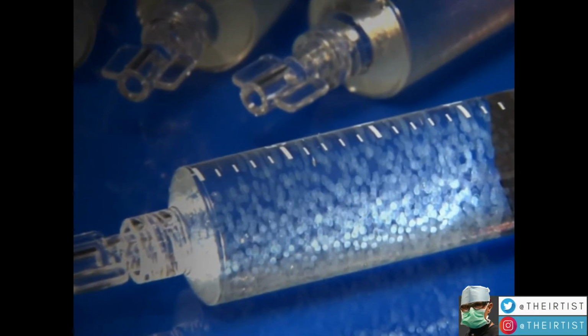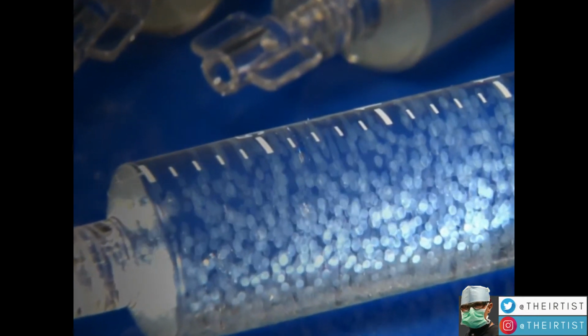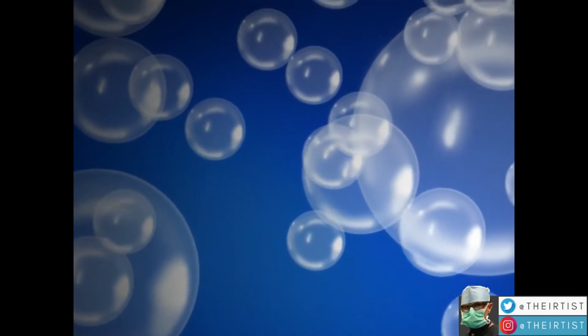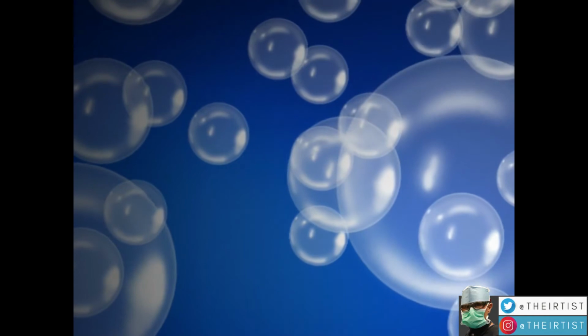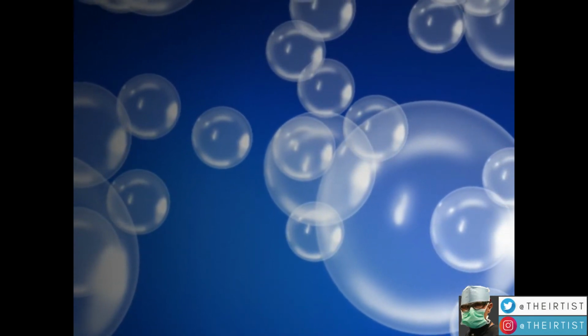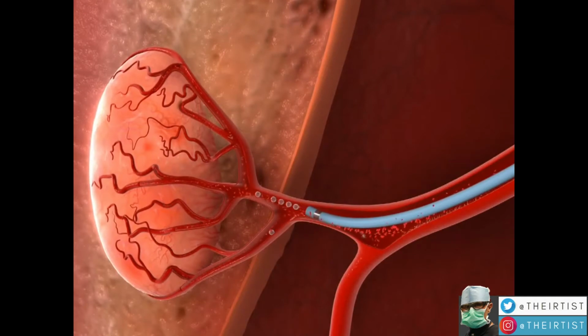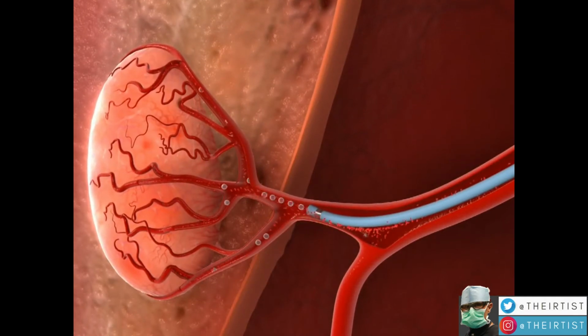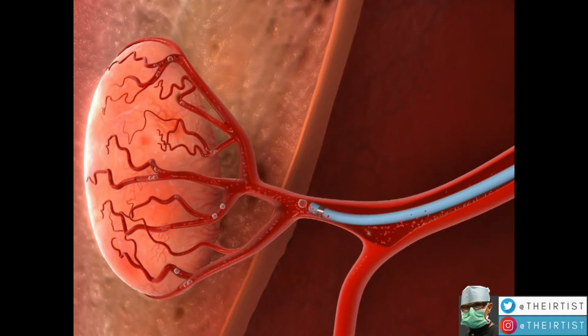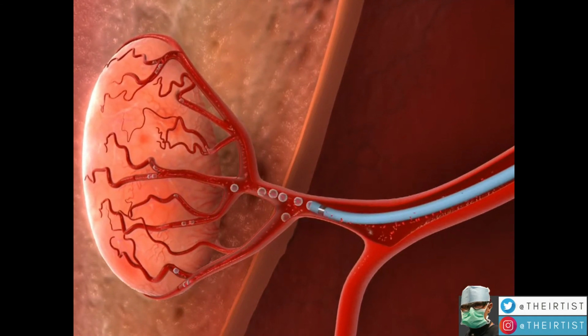So these particles come in a sort of suspension that we inject directly into the artery of the prostate. They will travel with the bloodstream all the way down to the tissue of the prostate, and they will cause a decrease in the blood supply to the prostatic gland, specifically to the median lobe of the prostate that caused the symptoms and squeezed the urethra.